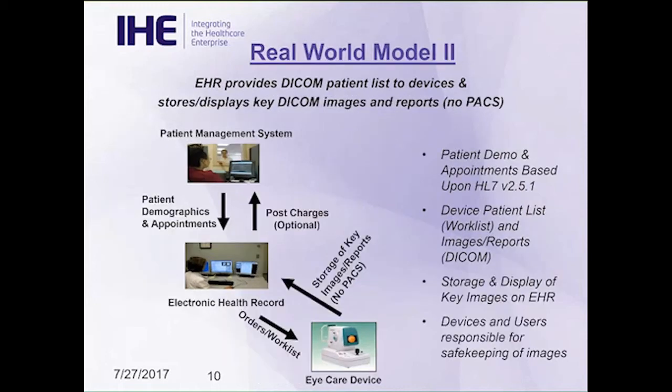So real-world model 2, the main difference is that the clinic determines that they do not want to purchase a PACS, so there is no image management system. And so let's take a look at some of the differences in how that workflow works for you.